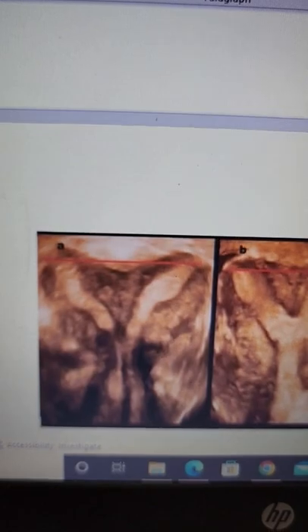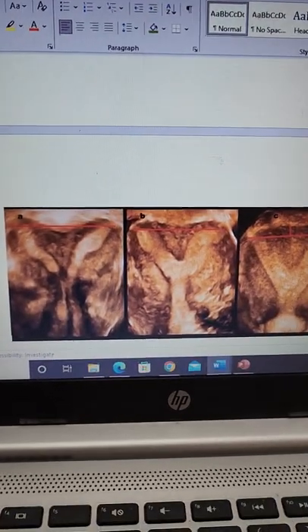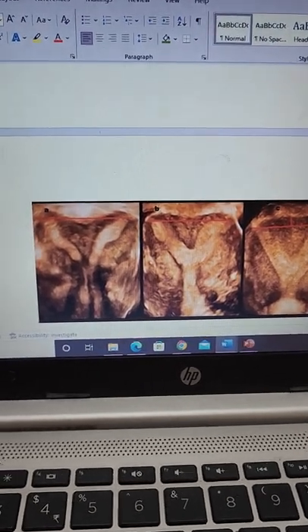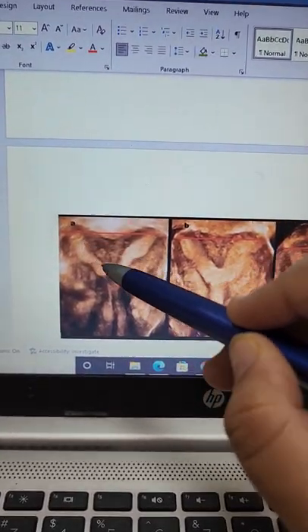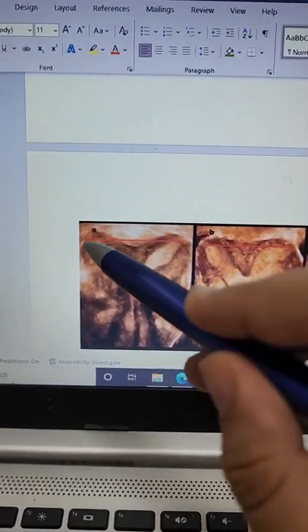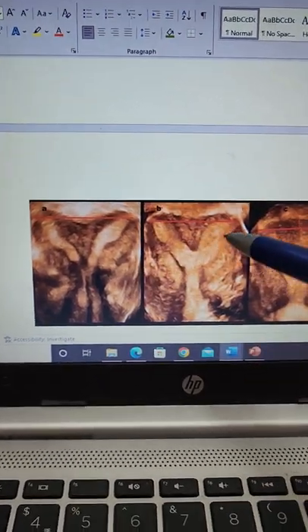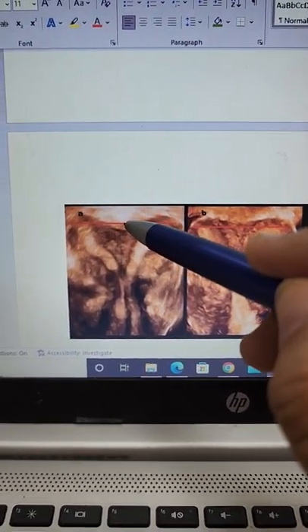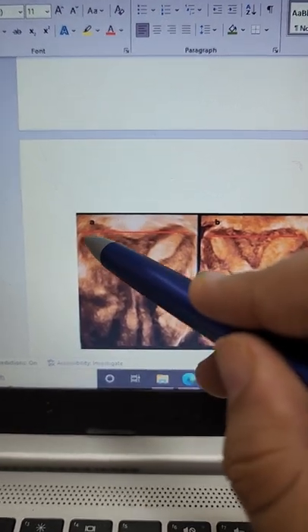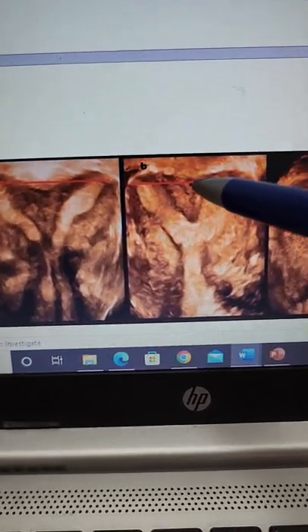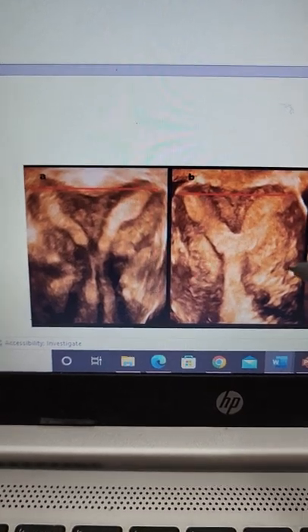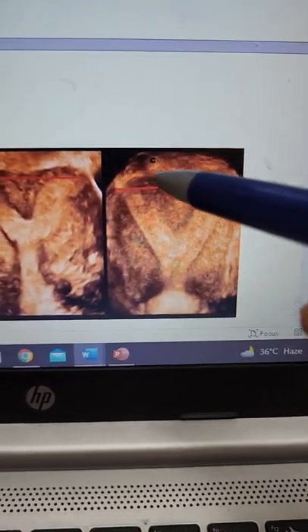So what do we resort to? The best non-invasive investigation of choice is a 3D ultrasound. On this 3D ultrasound, the white areas represent the uterine horns, and the indentation on top is the fundus. What we do is draw a line between the two uterine horns and see how it falls with respect to the fundus of the uterus. If the line is crossing the fundus, or if the distance between this line and the fundus is less than 5 millimeters, then it is a bicornuate uterus.